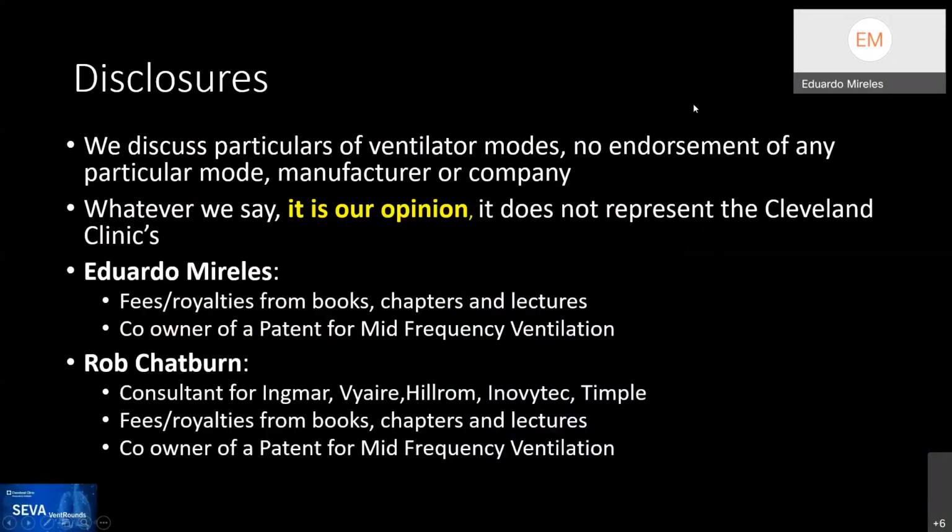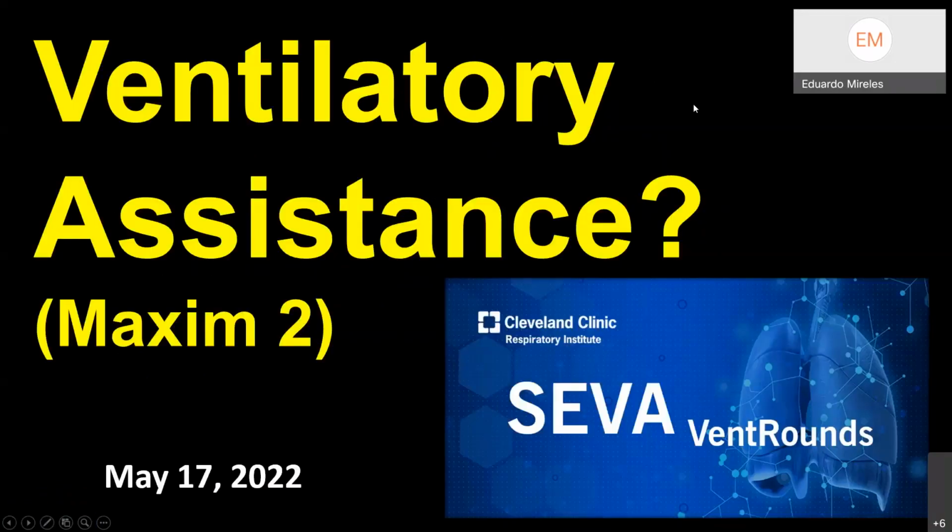All righty. So today, this is going to be following our behaviors of the last SEVA VentRounds. We did maxim number one, in which we defined what was a breath.